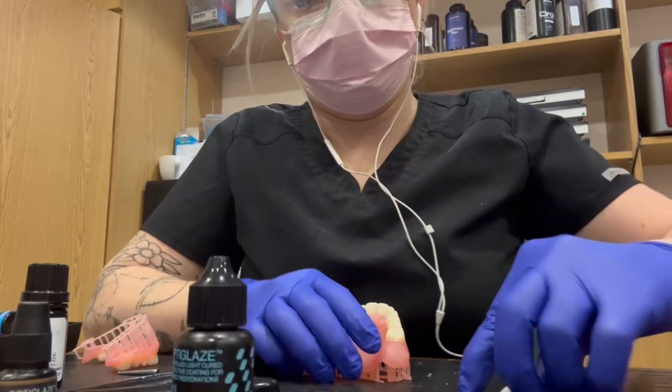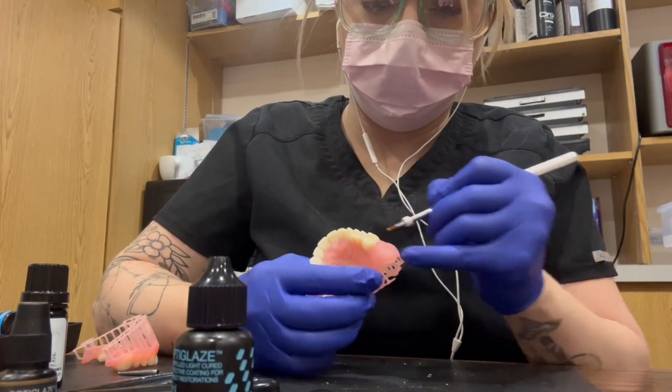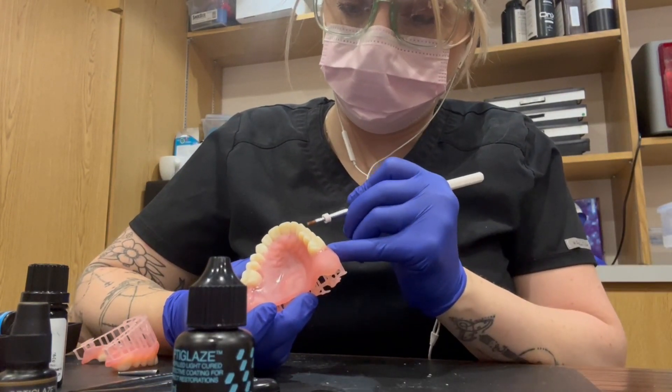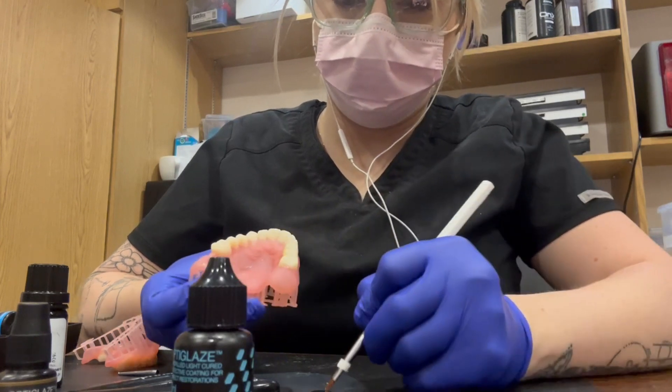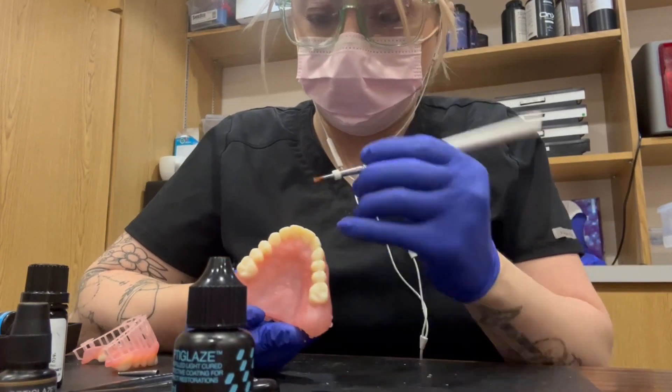Make sure you shake it well — this is a little sped up. The key when glazing these dentures is when you're on the base, making sure that you are getting a good thick coat on the base to give it that full nice all-over shine. You don't want any bubbles or separation.